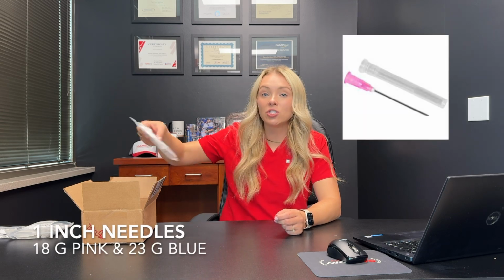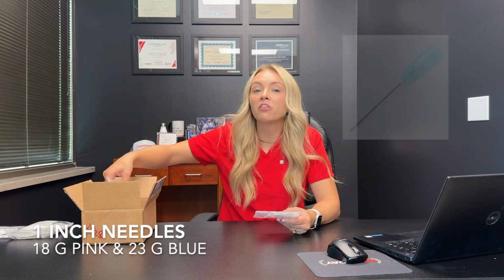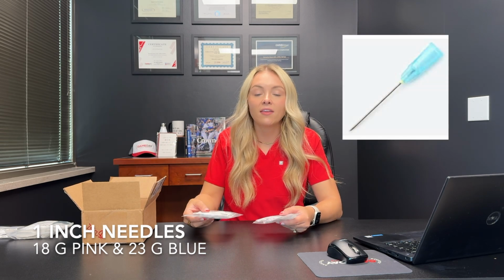Next in your box, you're going to find 2 different types of 1-inch needles. An 18 gauge needle that's pink and a 23 gauge needle that's blue. Gauge is a fancy term for needles that relates to the thickness of the needle, and the smaller the number, the bigger the gauge. The 18 gauge pink needle is thicker. This needle is used to draw the medication from the vial and into the syringe. The 23 gauge needle is thinner, and this is the needle that you're going to attach to your syringe to actually inject your medication.